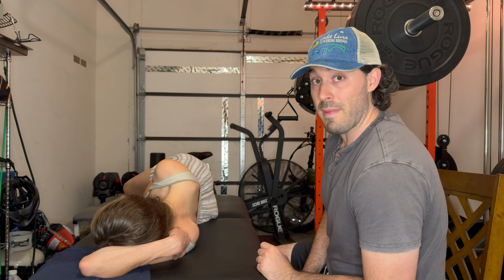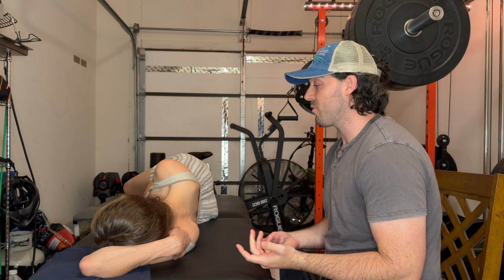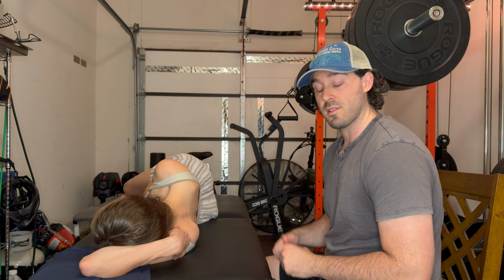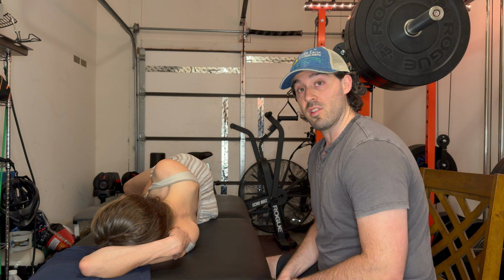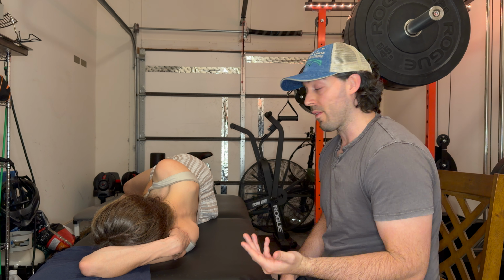All right, everyone, welcome back to the live demo version of the video. Today we're covering the levator scapula muscle. So this is the muscle that's closest near to the upper trapezius. Again, when we're thinking about doing this muscle, we have to realize that we're in a lung field. So we're going to try to bring the muscle tissue away from the lung field with each part of this.